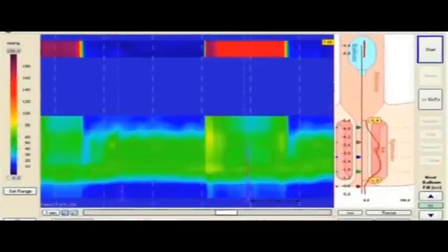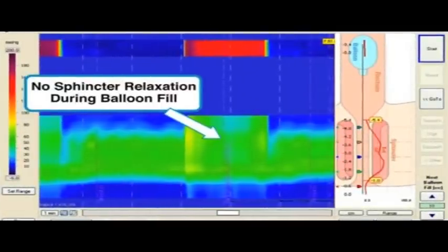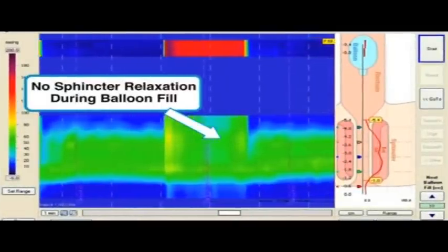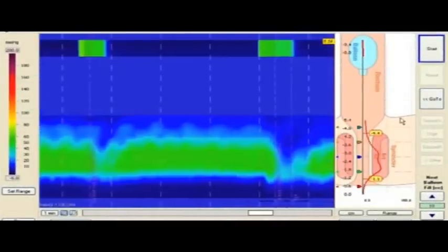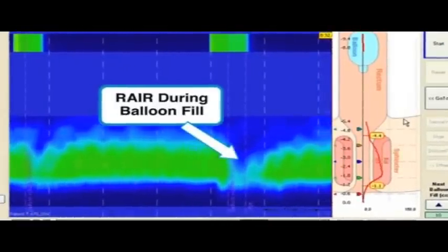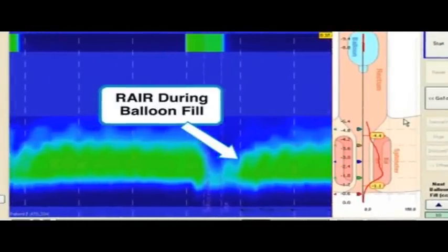In this subject, there is no relaxation in the sphincter during a balloon fill maneuver. The difference is easily visualized when compared to a normal subject with appropriate relaxation during a balloon fill.